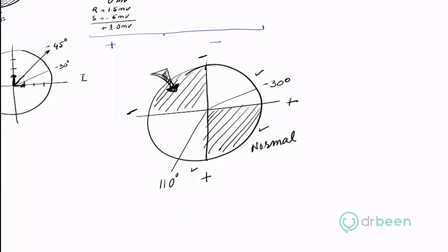However, when you have limb lead 1 positive and AVF negative, or lead 1 negative and AVF positive, then you need to disambiguate. You need to calculate further to see if it is within the normal or abnormal range.